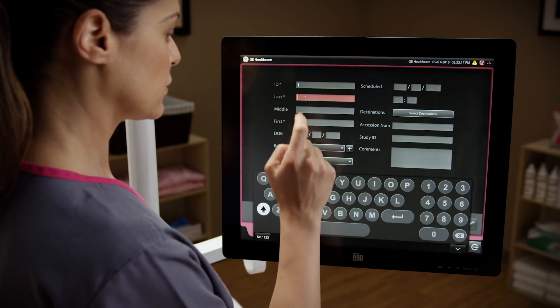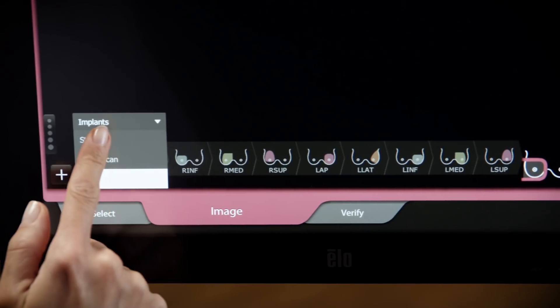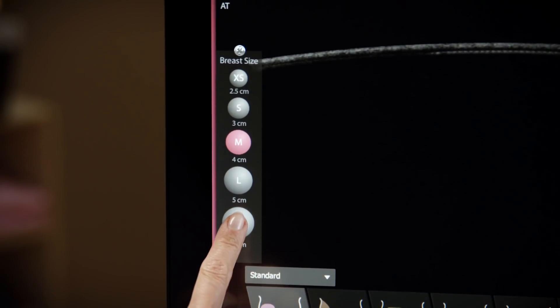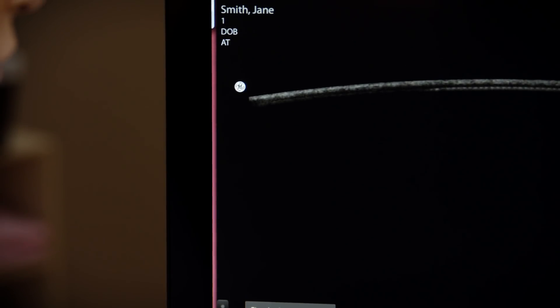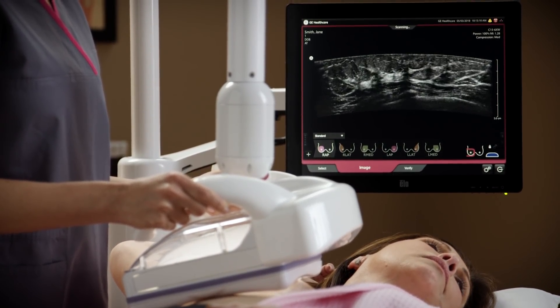The exam begins by selecting the patient information from a work list or entering it manually. The intuitive user interface enables quick parameter setup customized to individual body habitus. Gain and focus are automatically set, creating operator independence and repeatability.